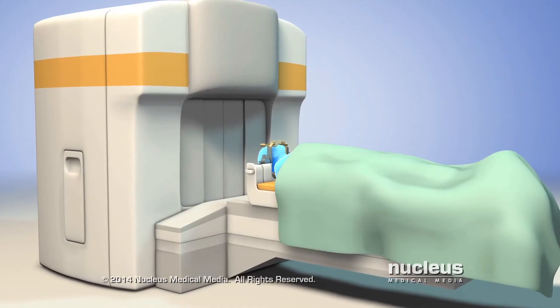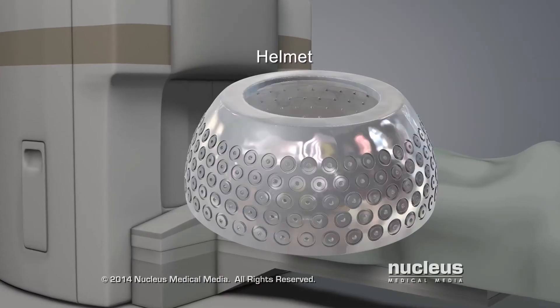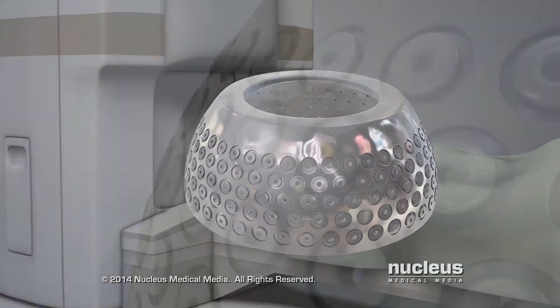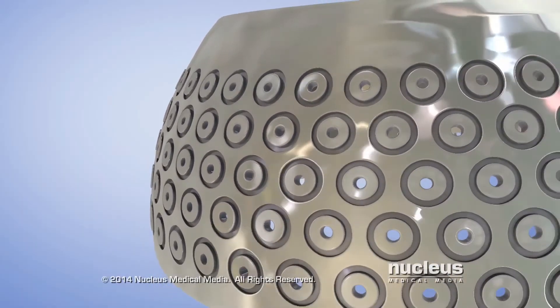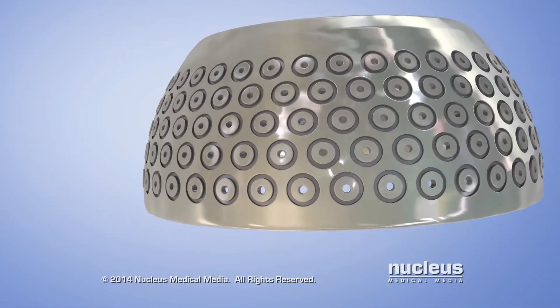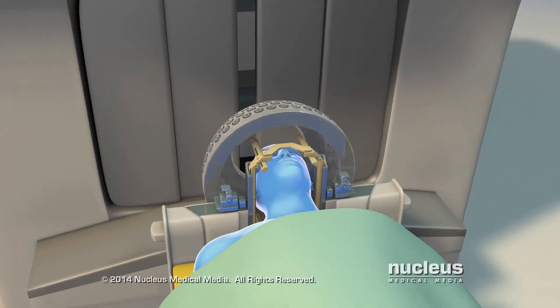Then, the patient will lie down on the Gamma Knife couch. A radiation helmet will be positioned over the head frame. The helmet contains holes that allow only the programmed radiation from the treatment plan to pass through. With the helmet in place, the couch will slide into the radiation unit.